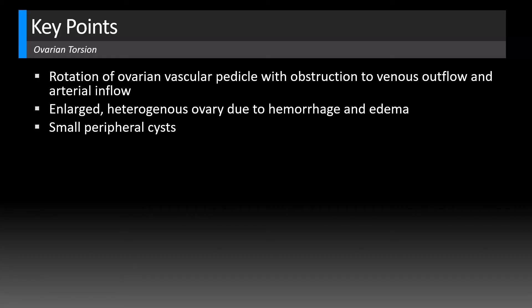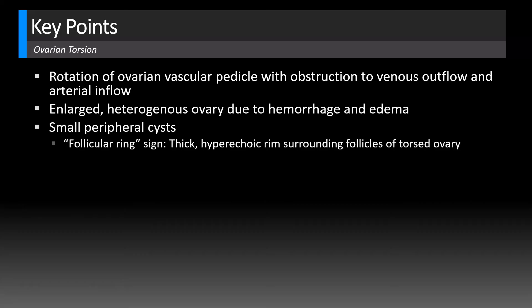You may wonder how to differentiate this appearance from polycystic ovarian syndrome, because that can give you a string-of-pearls appearance of small peripheral follicles. In that case, however, the ovaries will not be heterogeneous — they'll be normal in morphology with a prominent echogenic central stroma, without hemorrhage and edema altering the morphology. Additionally, with torsion you often see the follicular ring sign: a thick hyperechoic rim surrounding the follicles, something you won't see in the contralateral normal ovary.